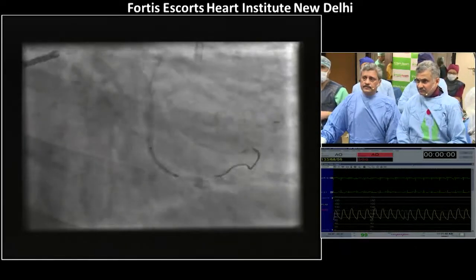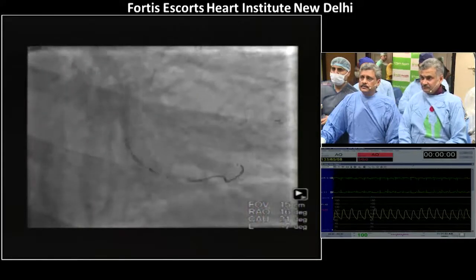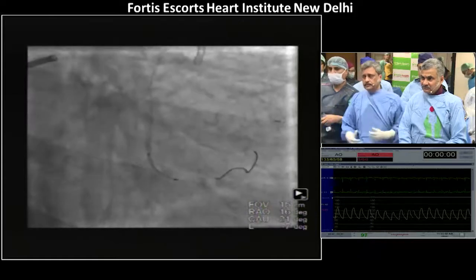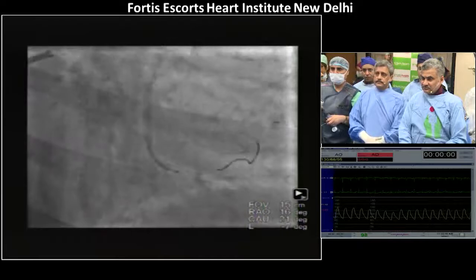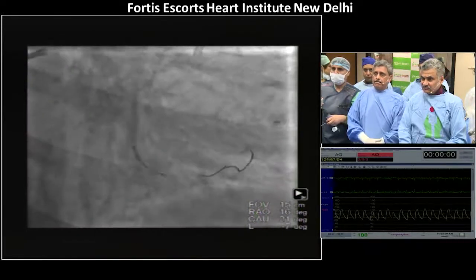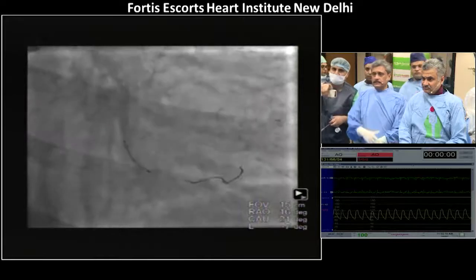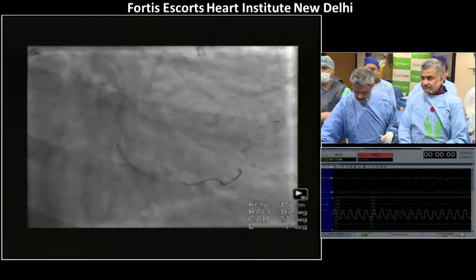Yeah, now it will come. So we're waiting for the whiz result.